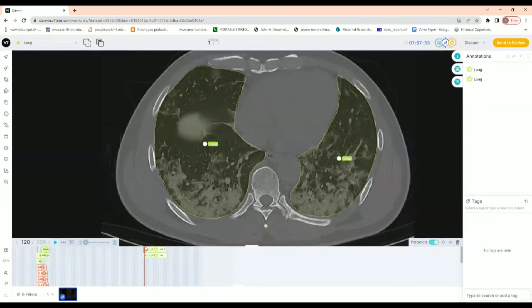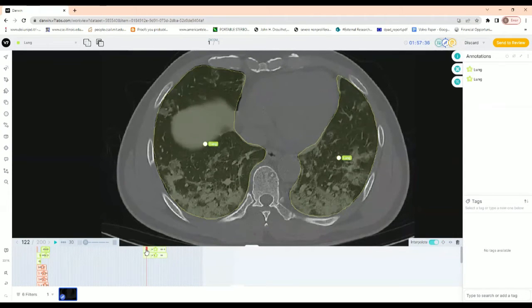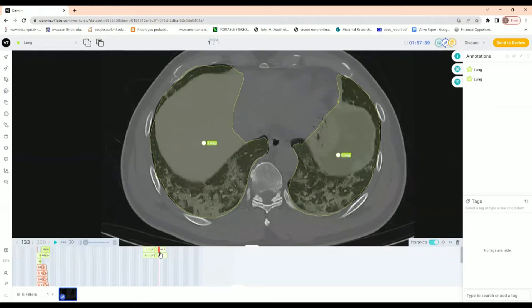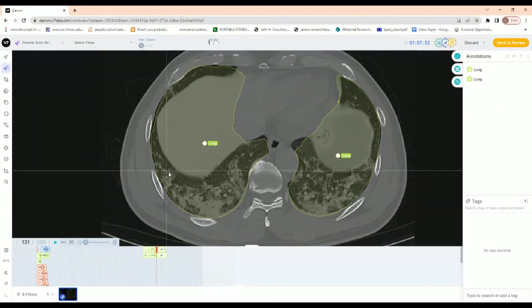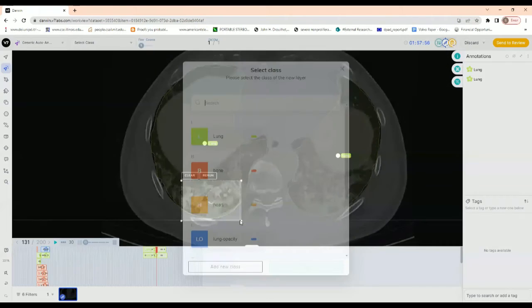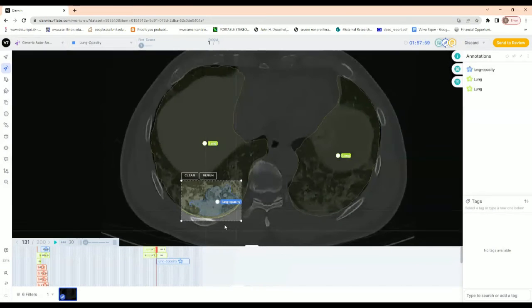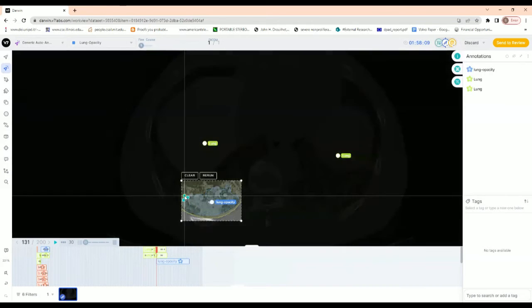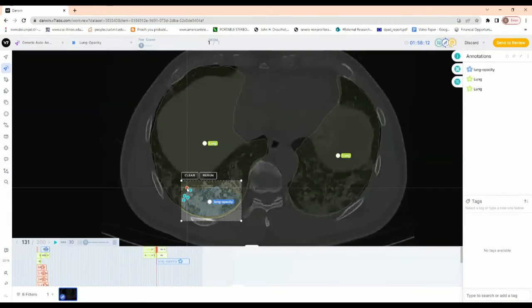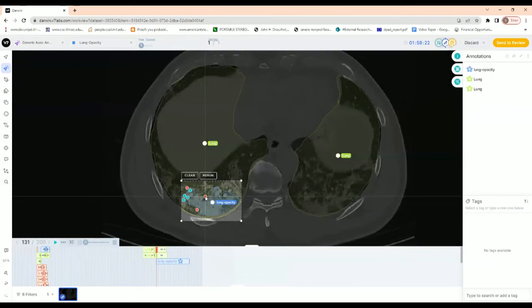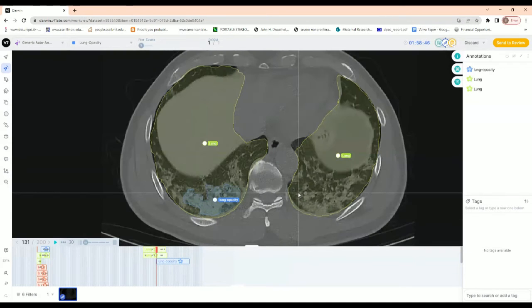One functionality I wanted to show is what happens when there are regions of interest that are overlapping. This is an example where you have a lung and also the auto annotate functionality. If I click on a region of interest, it will detect what that region is. I can also select and deselect regions — the blue dots mean capture more area, while the red dots mean the regions that should be removed from the region of interest. The same way I can continue in the other lung.